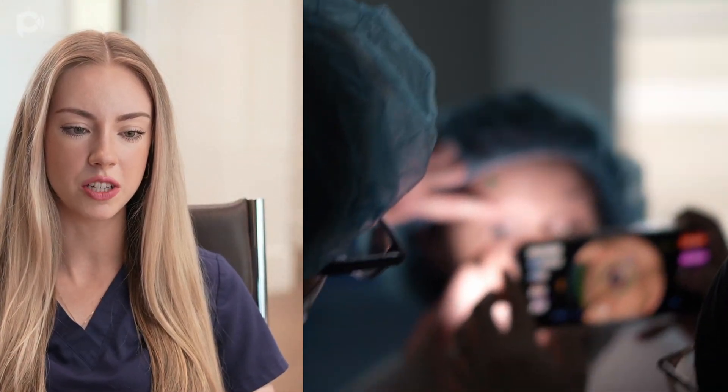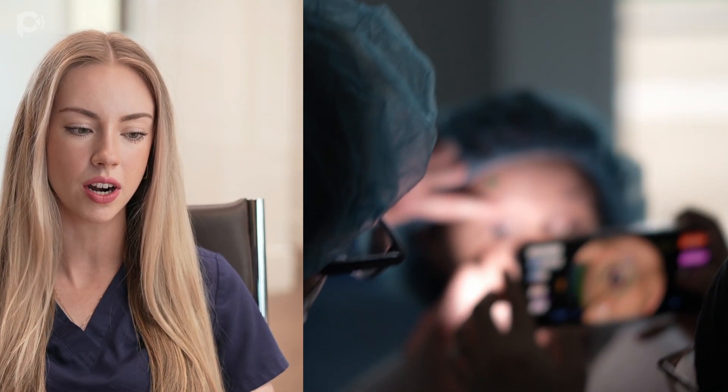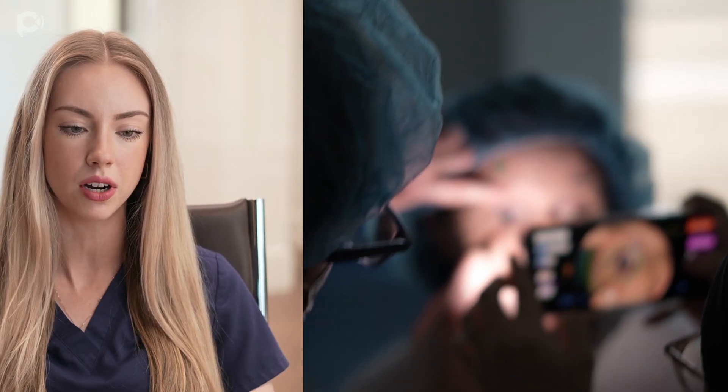My name is Emma Scott. I'm a physician assistant here at Parker Cornea, and today I'm going to be showing you how I mark the eye for cataract surgery using a toric lens. The very first thing we do, as soon as the patient is brought into the OR, is use a marking pen and make a random mark on the eye at the limbus. This can be done at any point — it does not matter where.